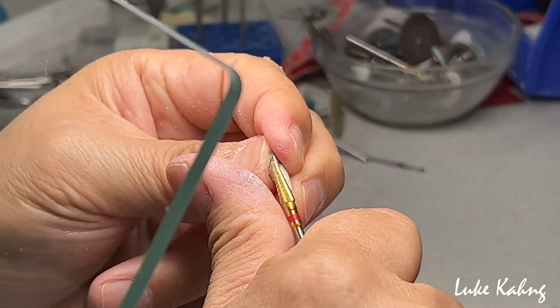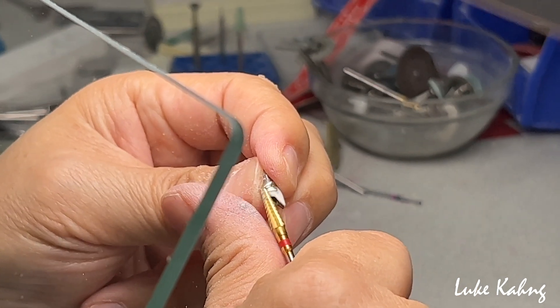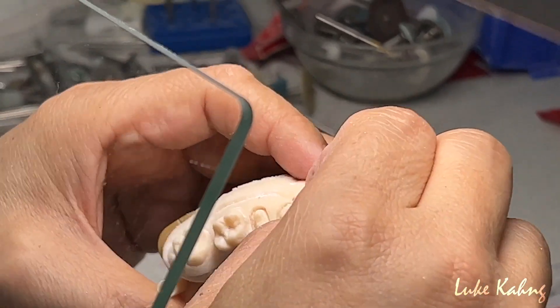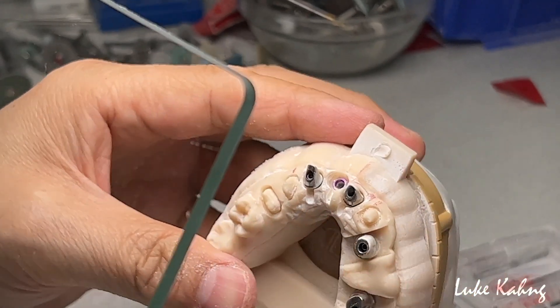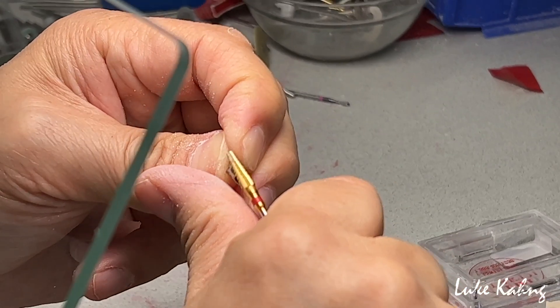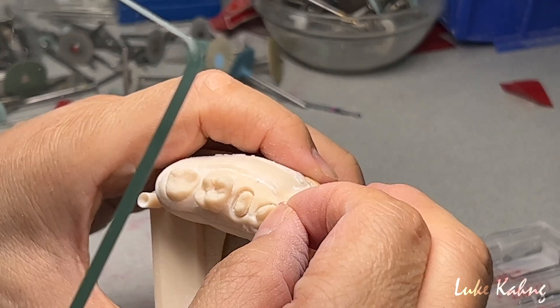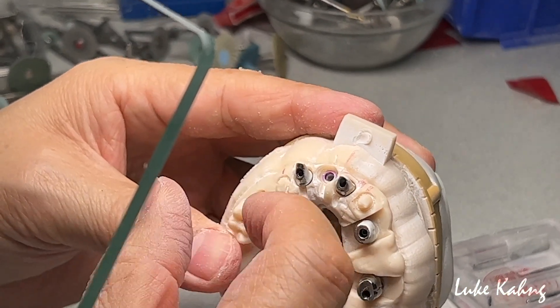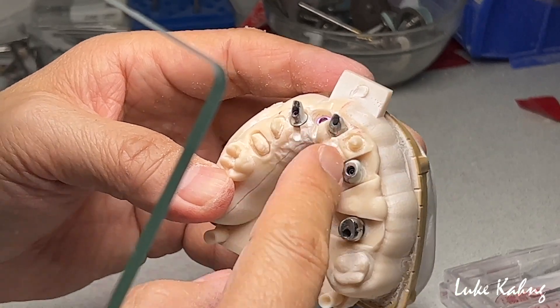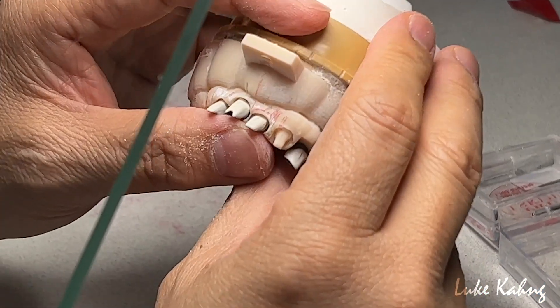I'm talking about the aesthetics — they will improve a lot. Now it's better. I can trim a little bit more here, let my designer have more room. Probably I can make the cantilever as well — two cantilever, single, single, cantilever. And here is another one. I trimmed a little bit facially. It was okay.